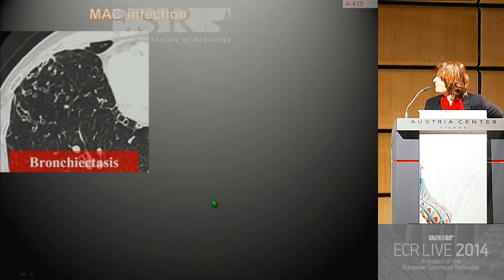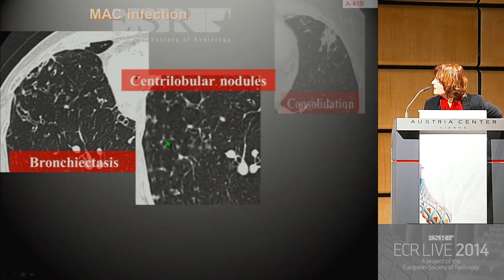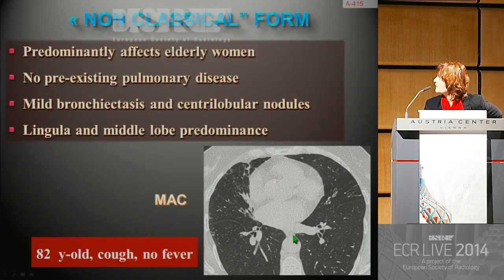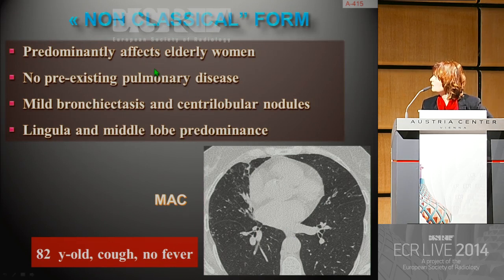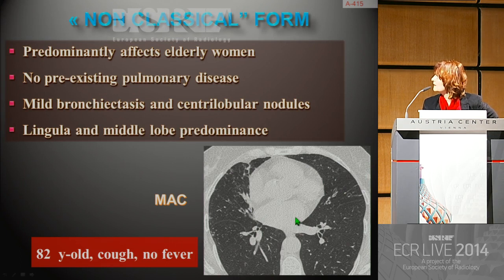The other typical CT findings in MAC infection are bronchiectasis, centrilobular micronodules, consolidation, and nodules that may be cavitated. The non-classical form, the second pattern, predominantly affects elderly women with no pre-existing pulmonary disease. It is typically represented by mild bronchiectasis and centrilobular nodules, predominantly at the level of the lingula and middle lobe. This 82-year-old woman presenting with cough and without fever shows a typical aspect of MAC infection in its non-classical form, known as Lady Windermere syndrome.